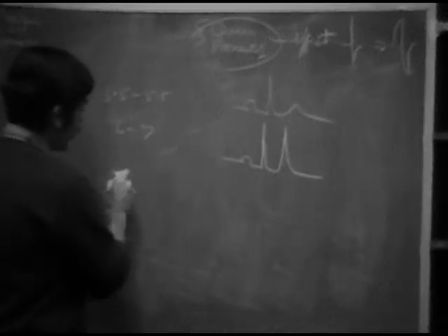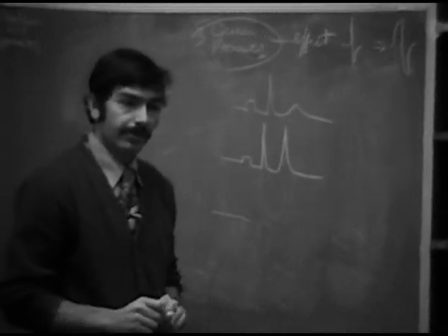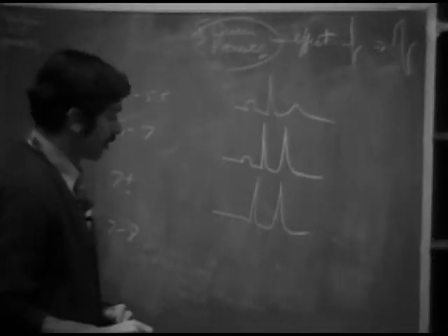And then as the potassium goes up, the P wave will diminish in amplitude, although the P waves will still reflect atrial contraction, you'll lose the amplitude of the P wave. It may look like you're dealing with a nodal rhythm. And the T wave will still remain peaked. And then finally, when you get up in the range of 7 to 8, what do you see in the electrocardiogram?